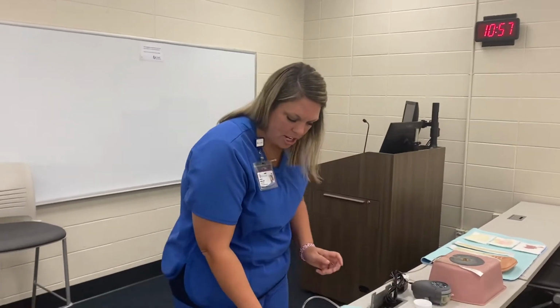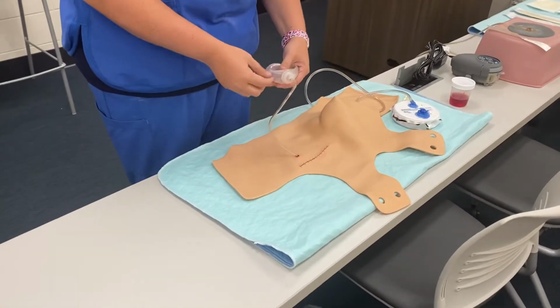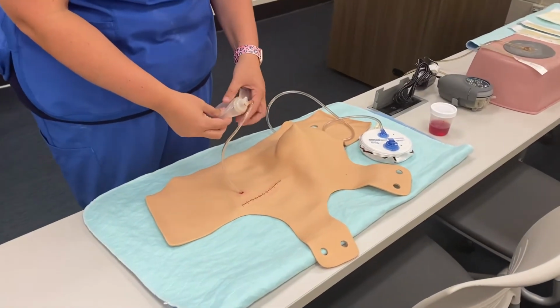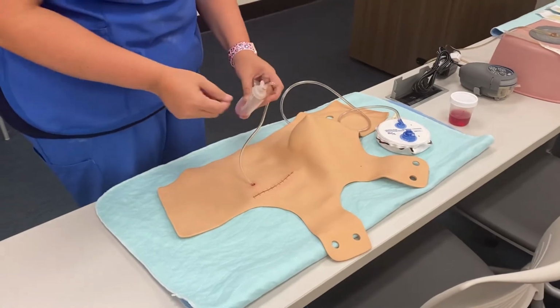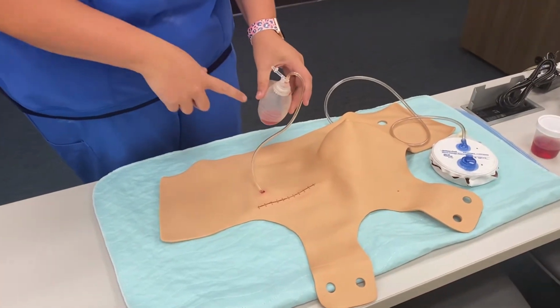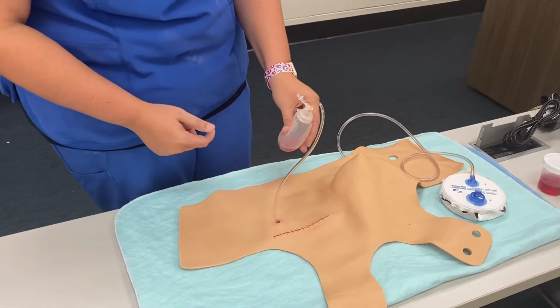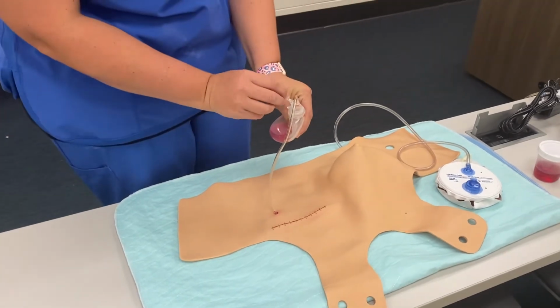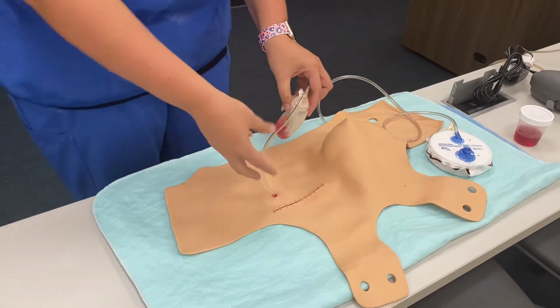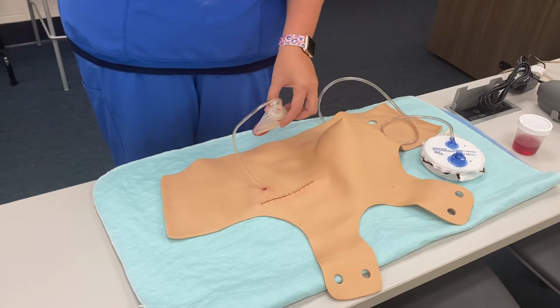All right, the other one is the Jackson Pratt drain. It works very similarly, okay? It has a tube and a bulb on it. How it works is that bulb has to be compressed, okay? She showed you that in lecture today. So if I was going to empty this, I would just open my bulb with gloves on, empty out this little bit of drainage, okay? And then to compress the bulb, I just squeeze it back and re-close it. You see it's compressed now, so that means it's actively using suction, vacuum to suck it out, okay?